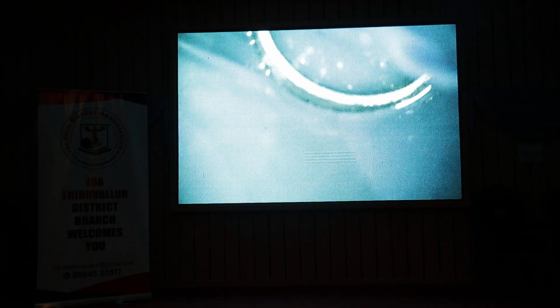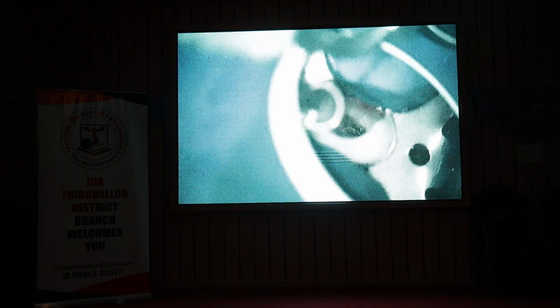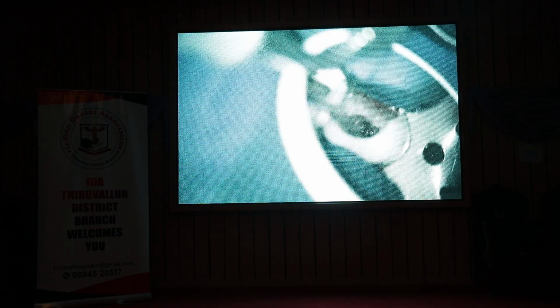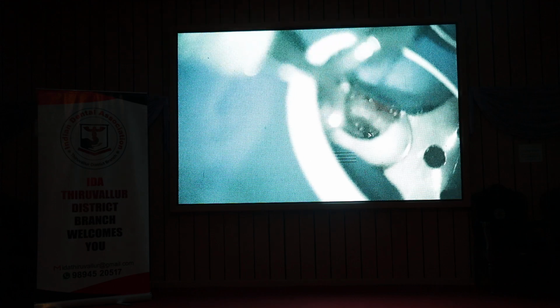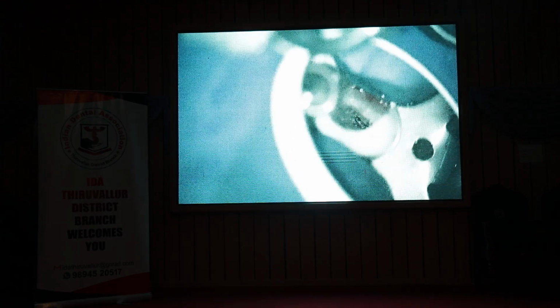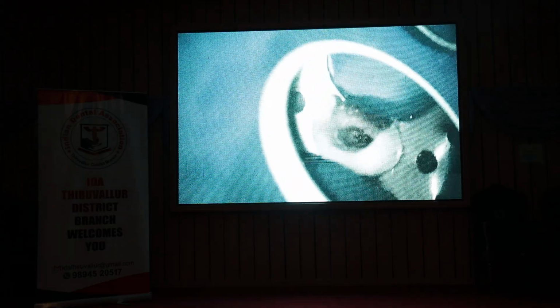I'm trying to use a U file there. Just go with this. Probably towards the end you can just see, it's slightly moving now there. And once it has come out, you can see that bit of dentine that I've removed, you can see one large canal there. Now that's all. That's the instrument there.